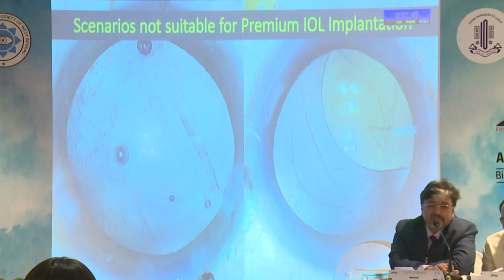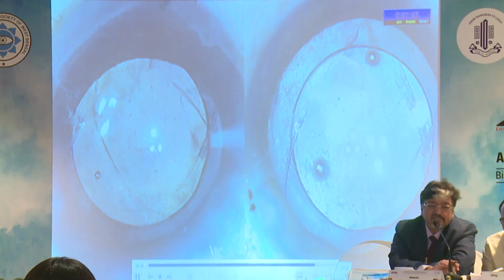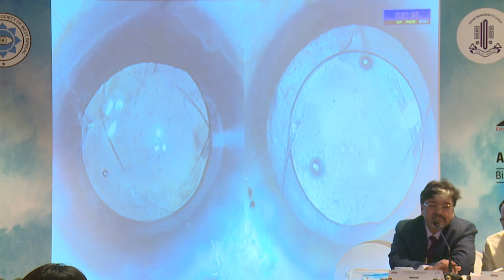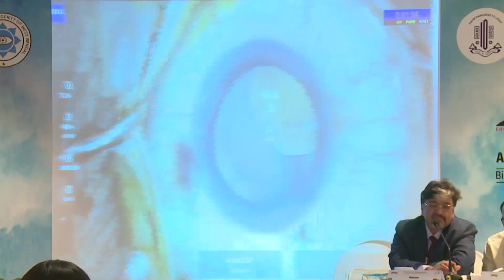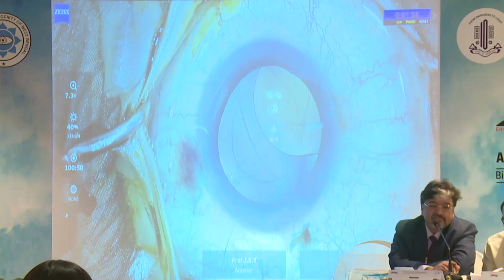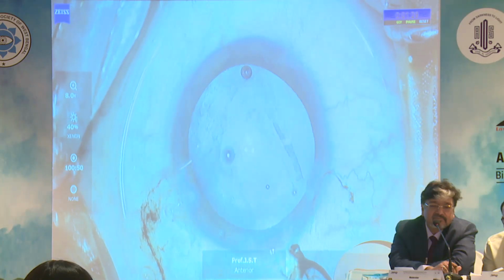Implantation of a premium IOL within the bag may not always be feasible in cases with PCR, and a multi-piece IOL implantation in the sulcus should be considered in these scenarios. These include cases with a large PCR with insufficient support or an extension of the anterior capsulorhexis.